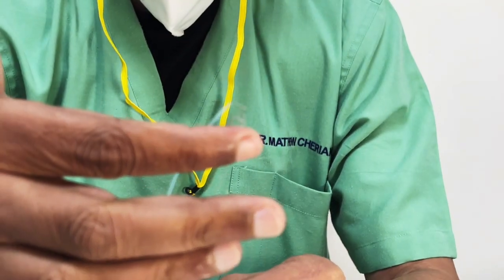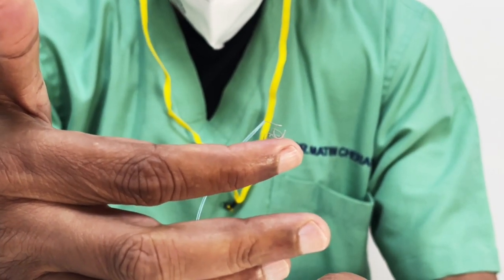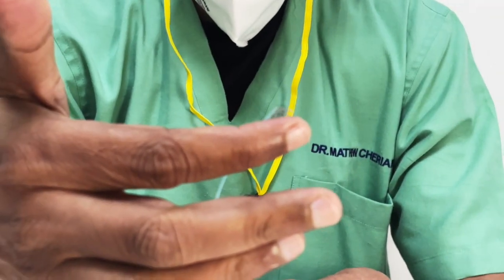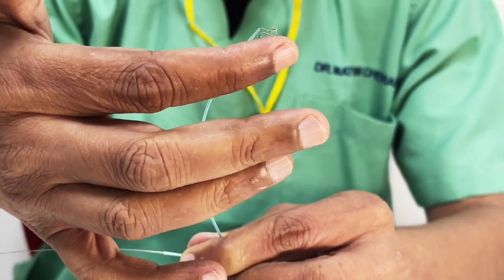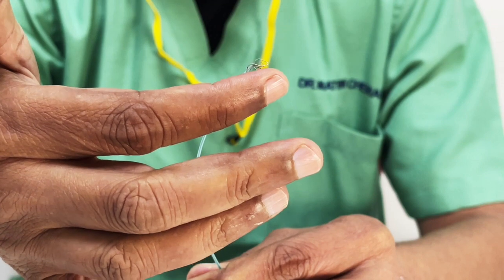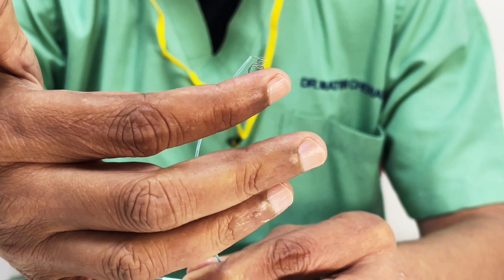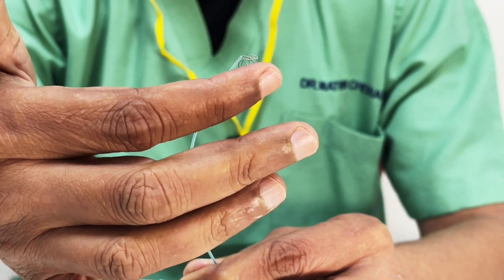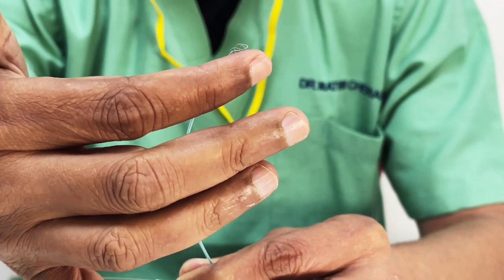So what it does, it is a spherical kind of coil, which is very good as your first coil. It also helps in a moderate sized neck, so it doesn't prolapse out. But remember, these types of 3D coils may sometimes not pack very well and they tend to compartmentalize. So suppose it's a 6 mm aneurysm, you start with a 6 into 6, a 6 mm coil. After that, you put a 5 mm, which could be a 3D. Now, after that, if you put helical coils, you will actually pack better, right?